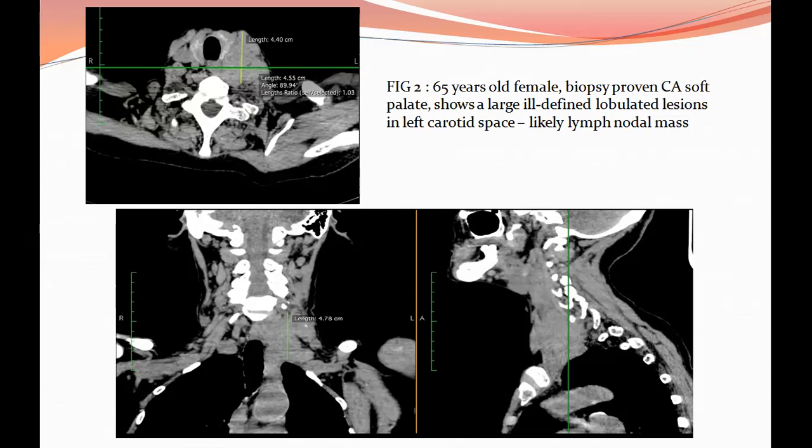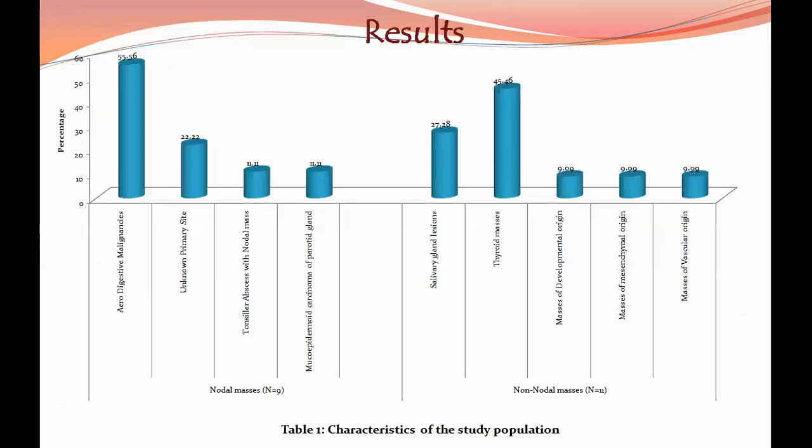Anteriorly, it is displacing the left lobe of the thyroid with partial loss of fat planes. There is also focal loss of fat planes with the esophagus. Anterolaterally, it is displacing the sternocleidomastoid muscle with loss of fat planes. Posteriorly, it is abutting the paravertebral muscles with loss of fat planes. On CT, the proper extent of the mass in relation to surrounding structures can be observed more clearly compared to ultrasonography.